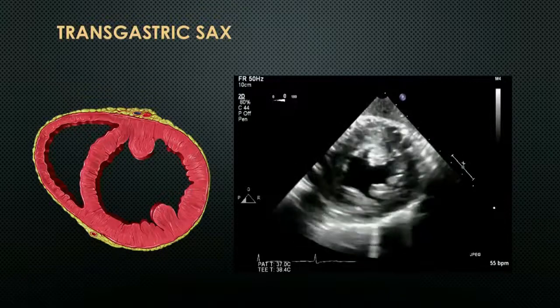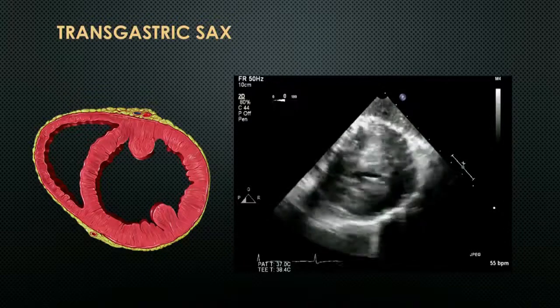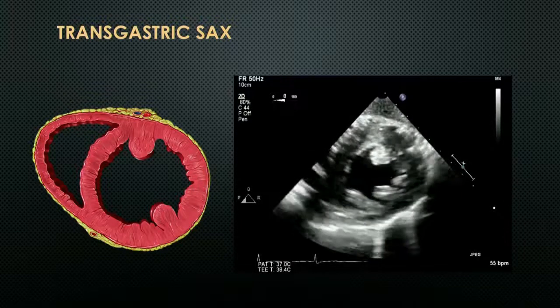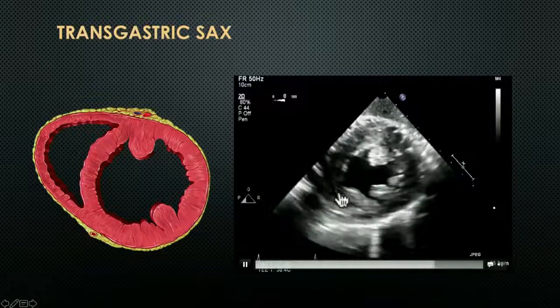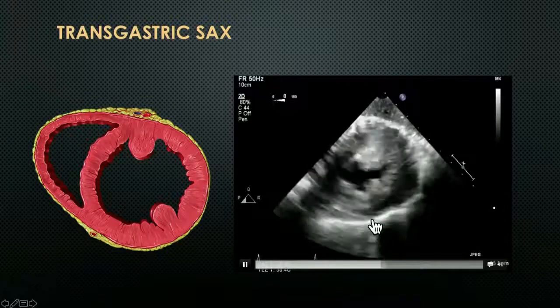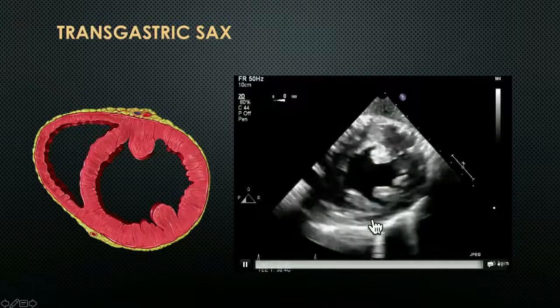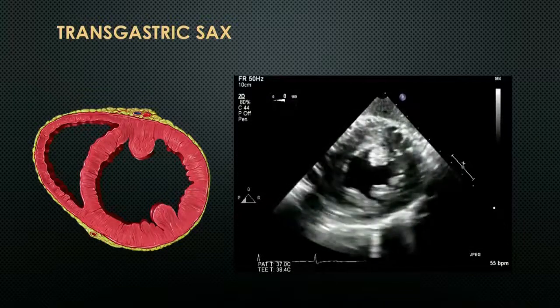The classic transgastric view is a transgastric short axis view. I display for you here the short axis 0 degree plane in the transgastric view of the LV at mid-ventricle. You can move either by withdrawing or advancing the probe.